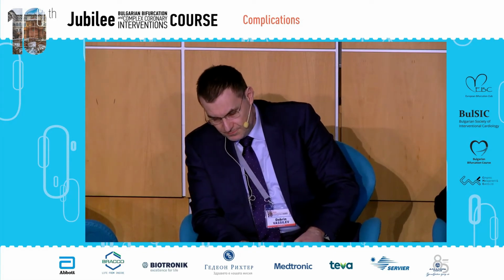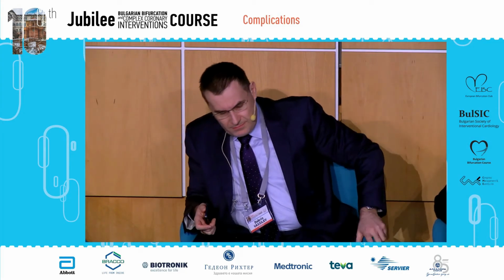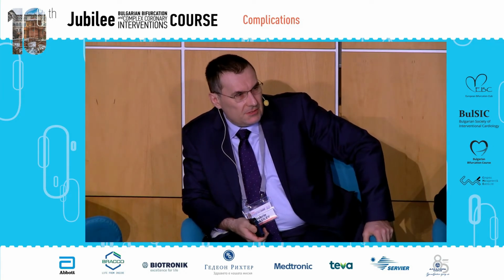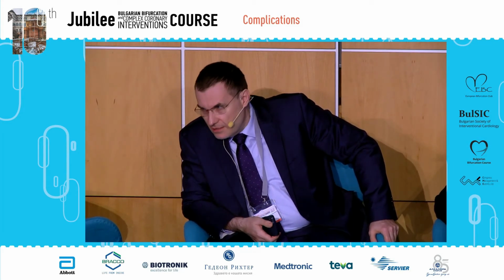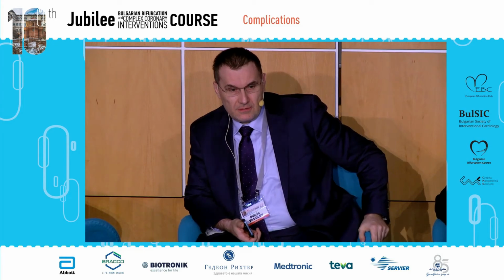We now have supply problems with Rota in Bulgaria with Boston Scientific, and we had to manage somehow. During the last month, I personally had 2 similar cases, and I had to go like a CTO with Confianza behind the calcium to dissect, re-enter, and stent subintimally.